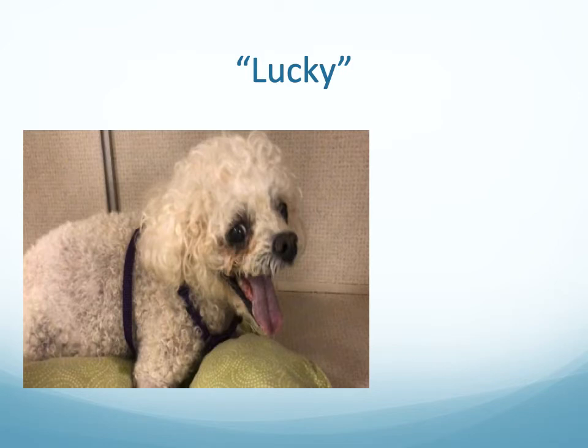I have mentioned this in the actual presentation. This dog has tick paralysis. Lucky, she can't move much. Her tongue's blue. This patient would likely require mechanical ventilation earlier rather than later, and I think that's one of the things that we need to be really mindful of, is that patients benefit from early mechanical ventilation.